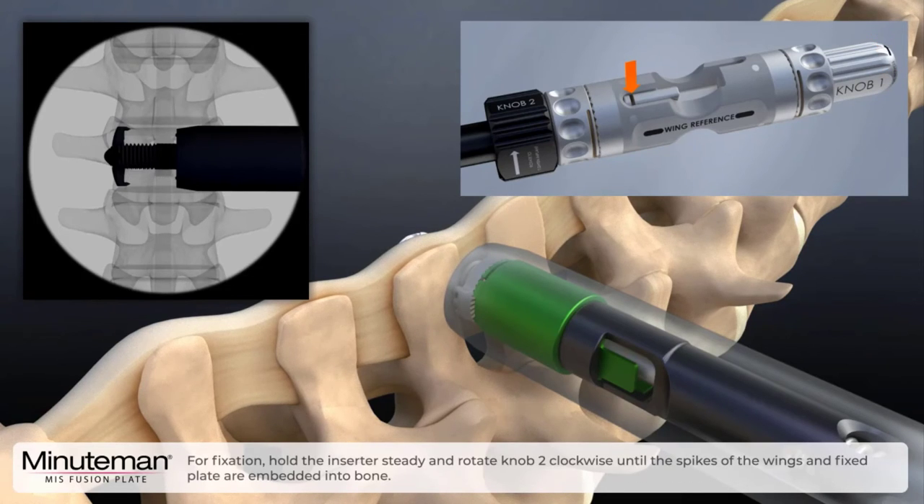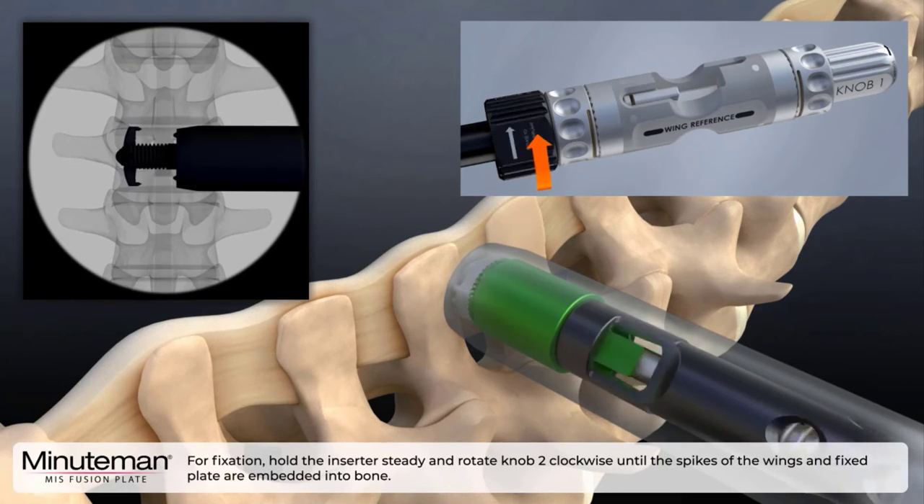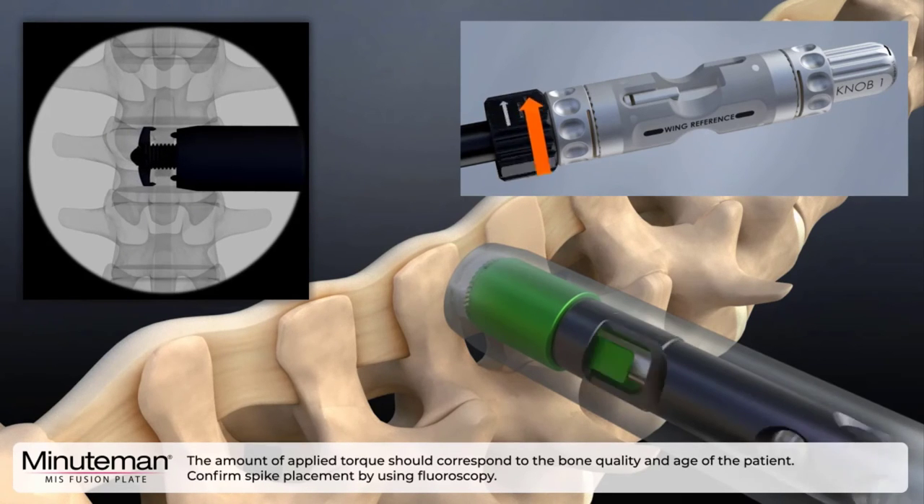For fixation, hold the inserter steady and rotate knob two clockwise turns until the spikes of the wings and fixed plate are embedded in the bone. The amount of applied torque should correspond to the bone quality and age of the patient. Confirm spike placement by using fluoroscopy.